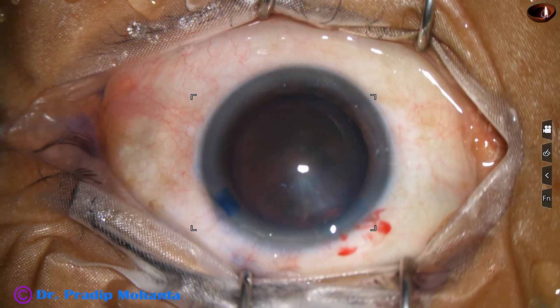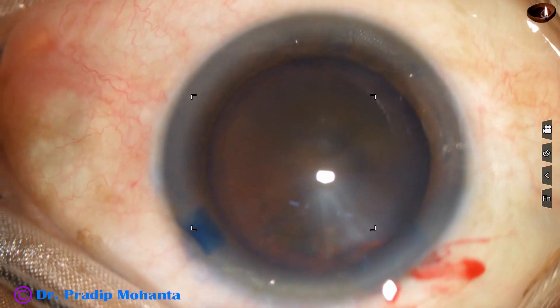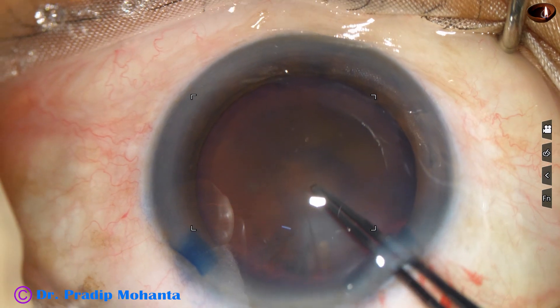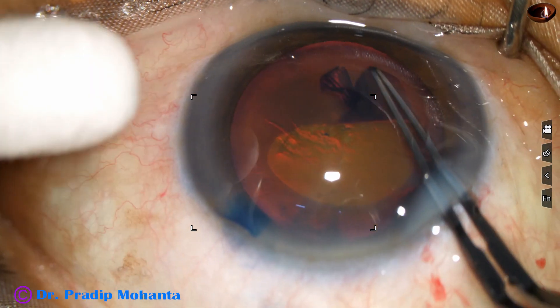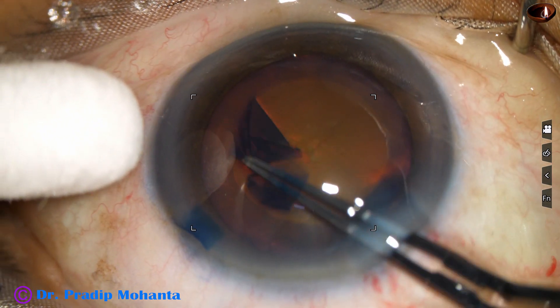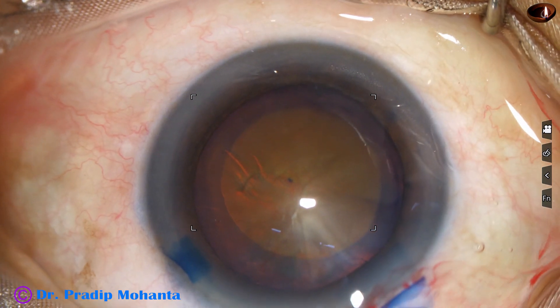And now is the time to do capsulorhexis. The microscope being used has step magnification — this is OMS 90 from Topcon. Now I go to higher magnification and do this rhexis with the utrata forceps. Size of this rhexis is about 5.5 millimeter.